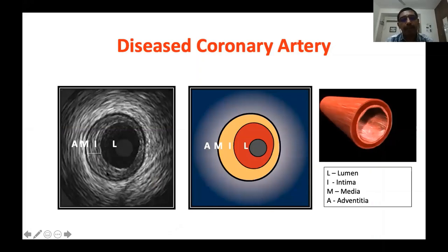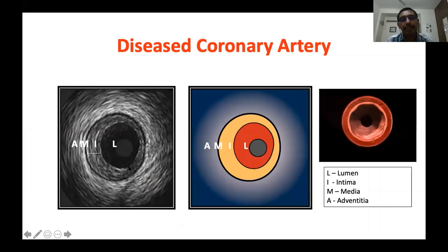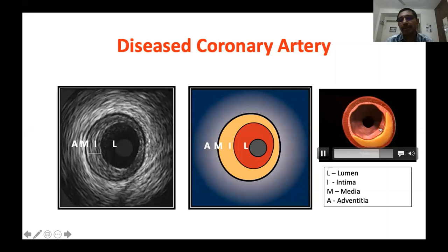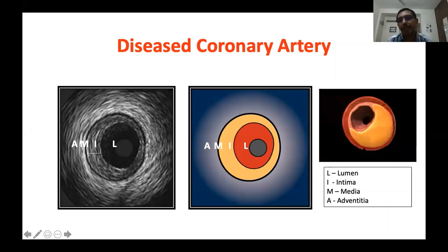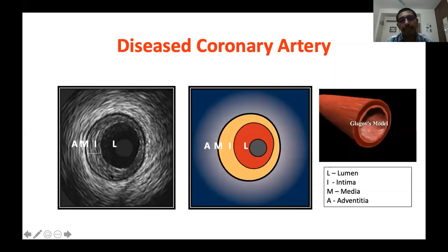As we all know, atherosclerosis is a disease of the intima. With the development and progression of atherosclerosis, plaques accumulate in the intima and intimal thickness gradually increases. This is the typical appearance of a diseased artery. The echogenicity of this plaque depends on its constituents — whether it is made up of lipid, fibrous tissue, or calcium. This is a typical example of a plaque — you can see the plaque material developing and gradually narrowing, all located in the intimal space.